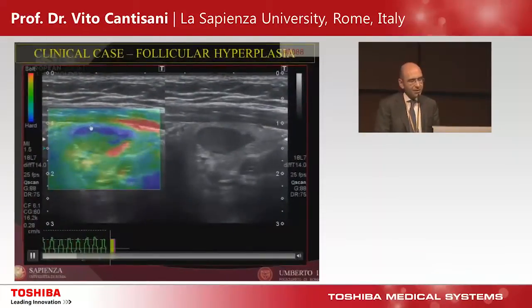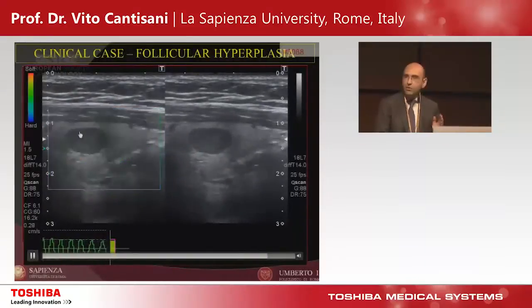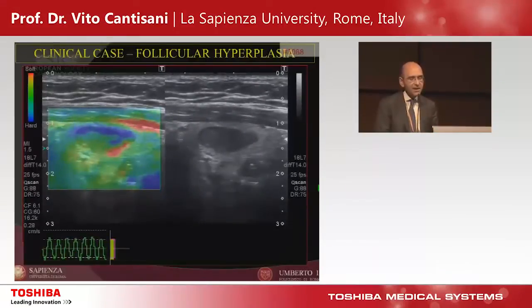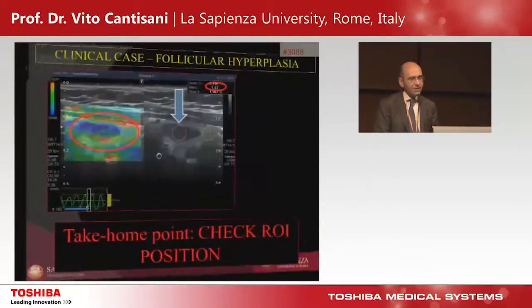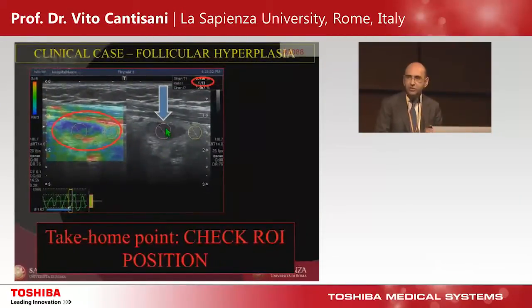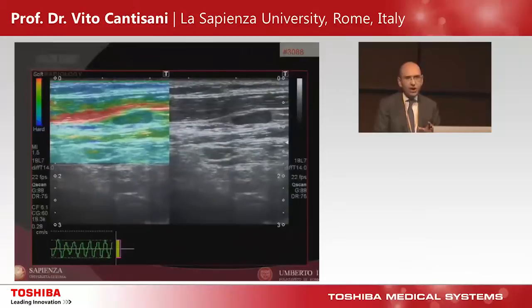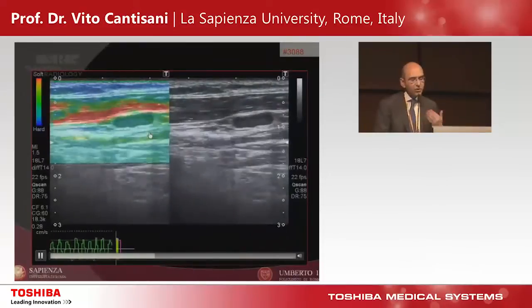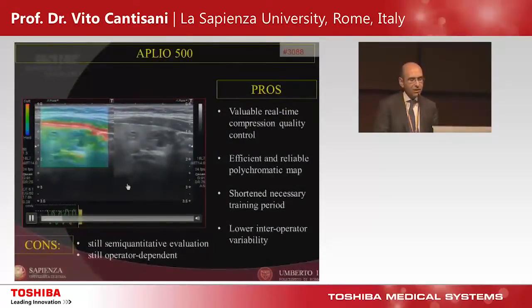Look at this multilayered lesion — I call this the 'rainbow sign,' meaning it is neither purely cystic nor purely solid, but a mixed lesion. If you place the ROI here, you get 2.14, which is in the gray zone. But if you place the ROI within the nodule but not including all the tissue, you obtain different values. So an important point: always check the ROI position. You can also follow lymph nodes in a one-stop evaluation.